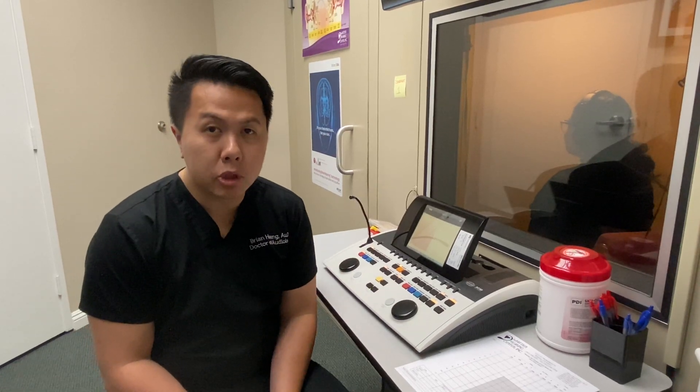The next thing we're going to do is have you go inside the sound booth in order to do a hearing test. You will be instructed to hold a clicker and press on it whenever you hear the beeps. We will normally start on the ear that is better and then followed by the worst ear. We have Paloma sitting inside and I'm going to demonstrate how that works.